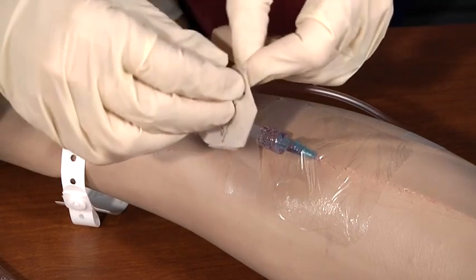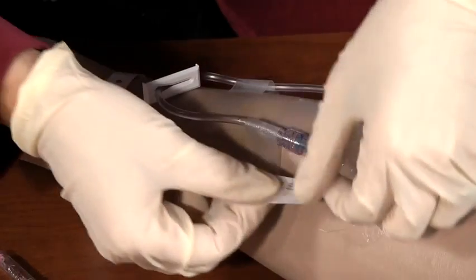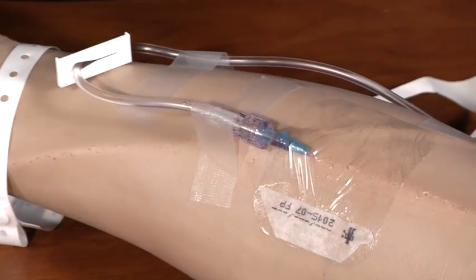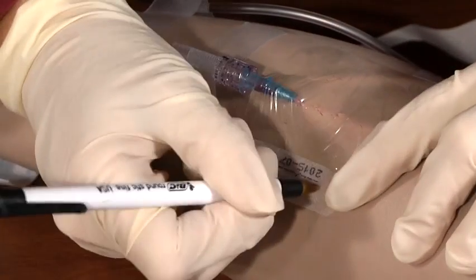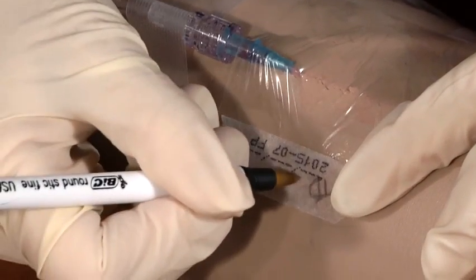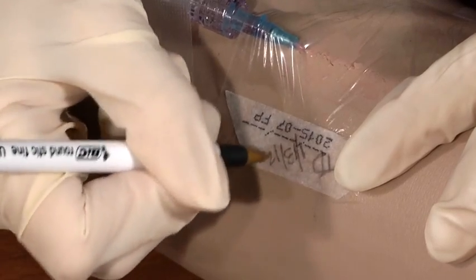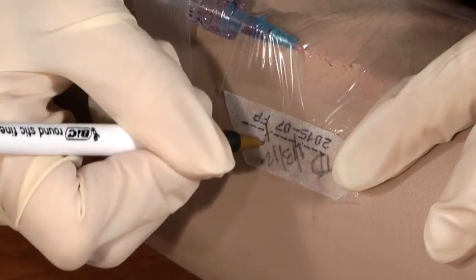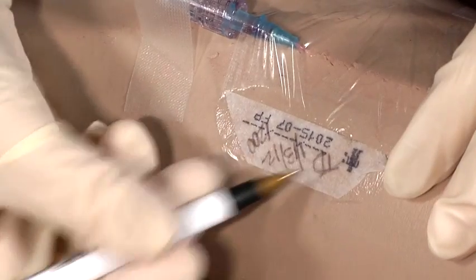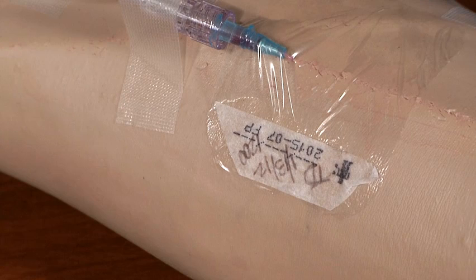Okay, you can see here there's a piece of the op site that you can use to document who did it and when it was done. So this is the part where you want to put your initials, the date, and the time. And you want to use military time, of course. That's hospital time. So I've got my initials, the date, and the time. So I know when this needs to be changed.